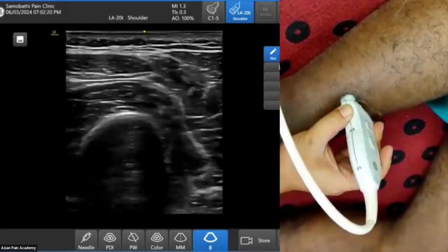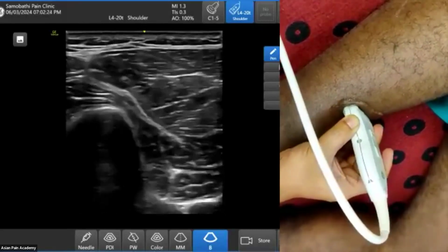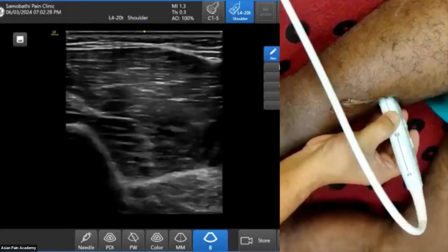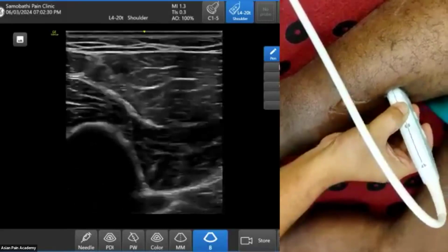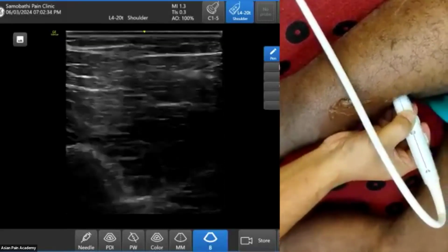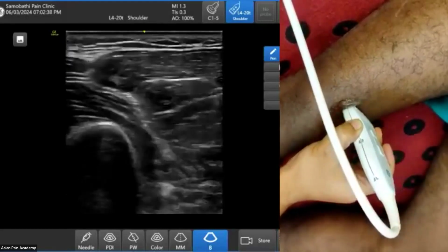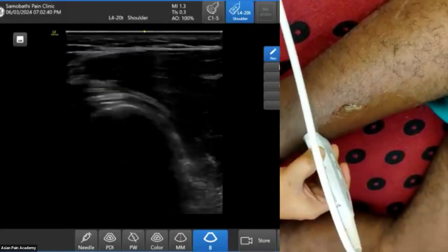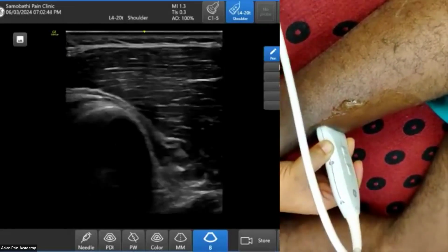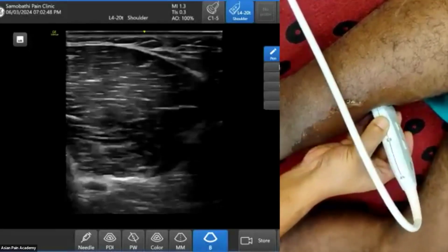Okay. So first let us see the vastus medialis. You can see that this is the femur, femur cross section. The vastus medialis is there, and this is the big vastus medialis. When we come down, it becomes smaller. So vastus medialis in this area becomes small. Otherwise, vastus medialis is the biggest muscle of all the quadriceps.